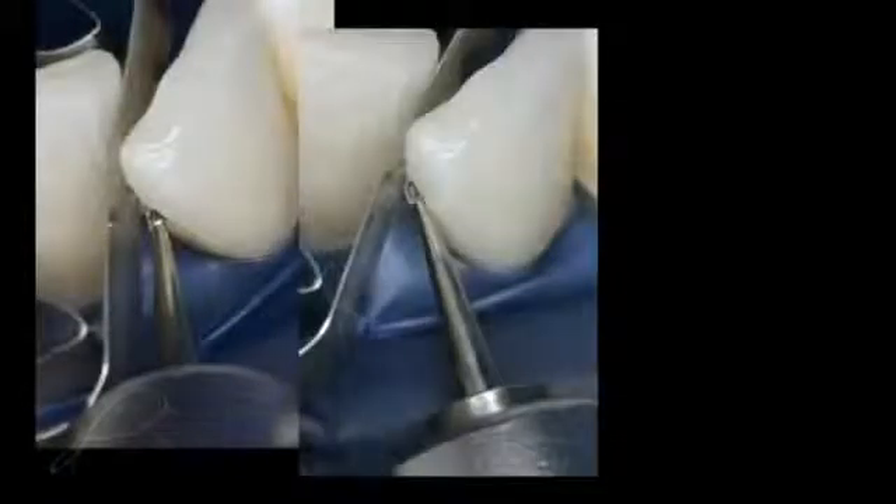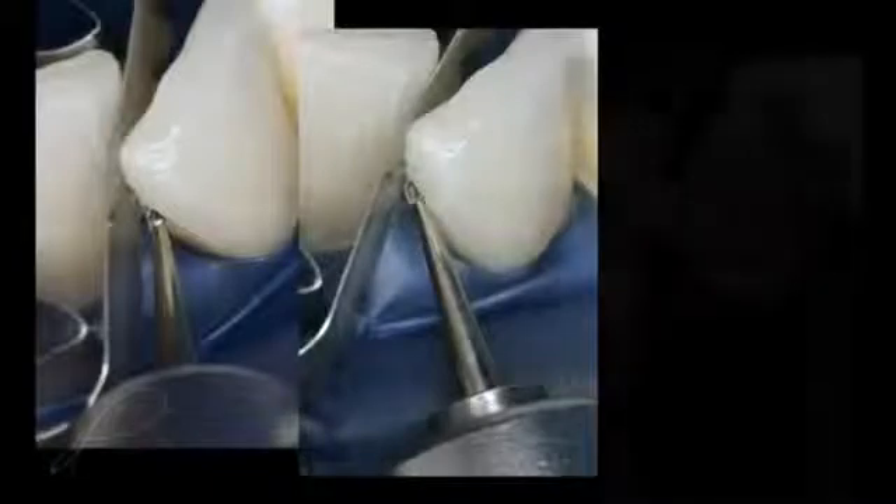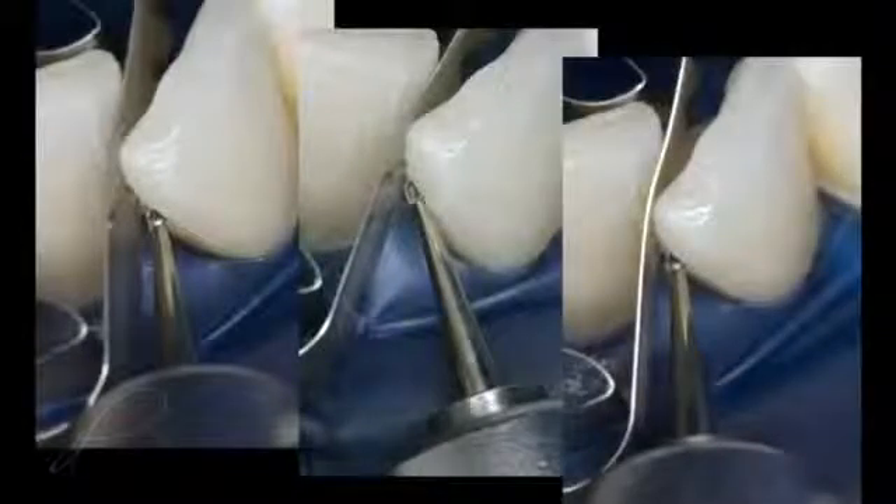Once anesthesia had been administered to the patient, the caries was removed with a number two high-speed round burr, which produces rounded line angles. The outline form was as conservative as possible without removing healthy tooth structure unless dictated by caries. A circumferential bevel is placed in enamel using a tapered diamond burr, a DET3 by Brassler USA.